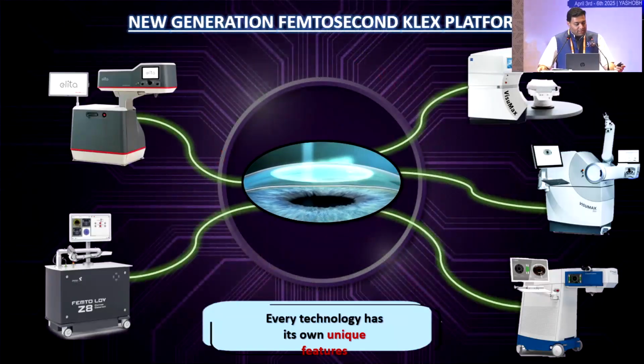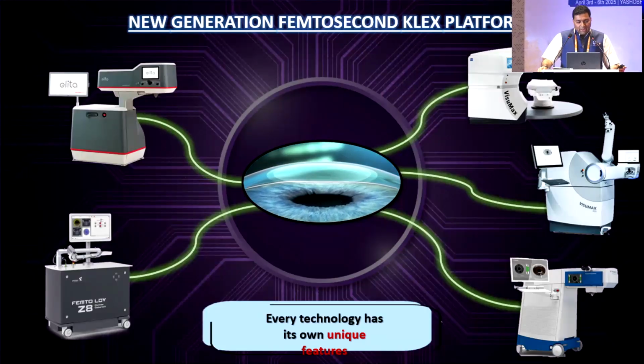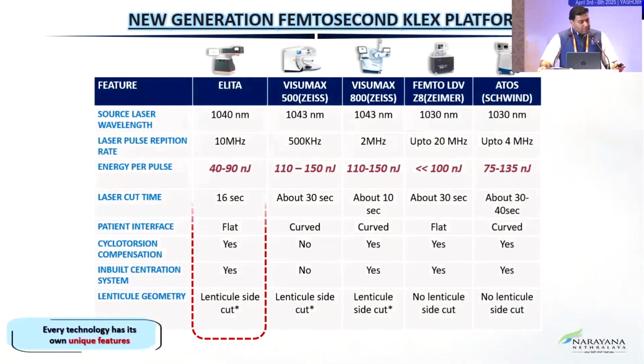So when you look at the new generation of femtosecond lasers, the platforms which I'm going to speak about today, you now have different energy settings, different spots, and different flat interfaces which you need to be aware of. And suddenly, after more than 15 years, we got this slide which confuses everybody.